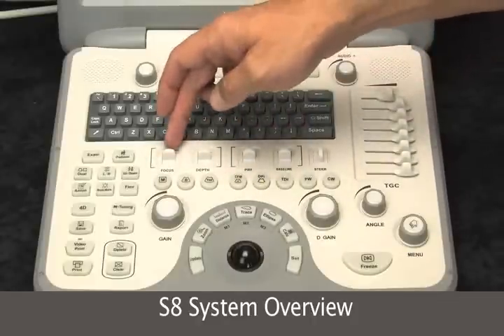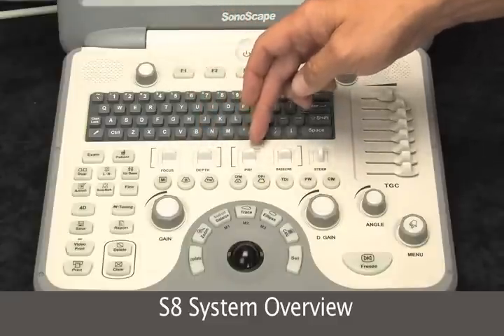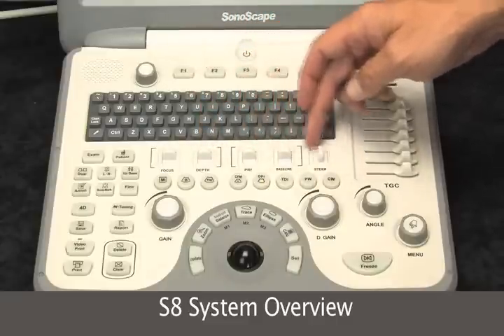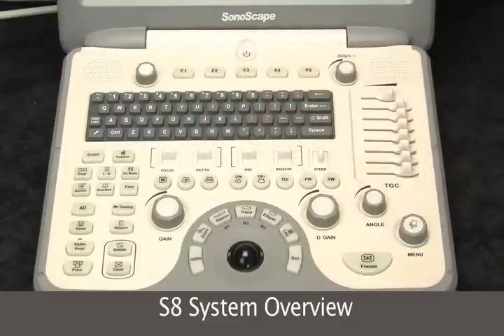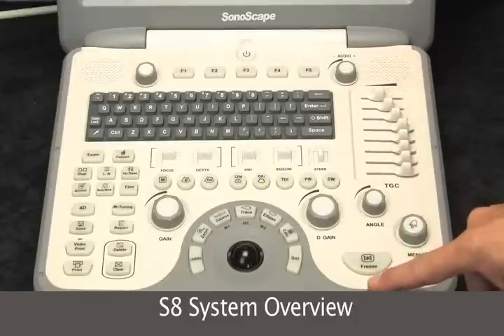Focus changes your focal zones on the system. Depth, pulse repetition frequency, baseline, and steering for your Doppler. Over on the right we have the TGCs and your freeze button.